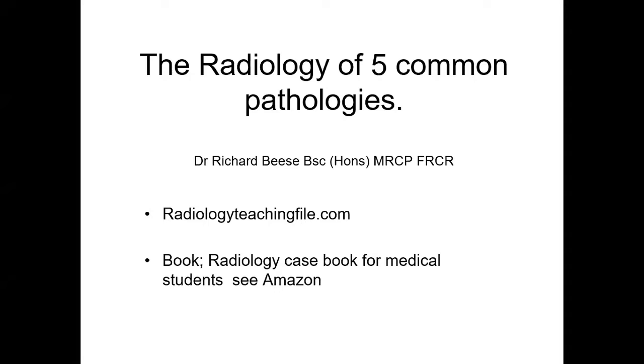in the West. Now, I realize that these do vary around the world. I gave a talk recently on global health through the prism of ultrasound, and we went around the world looking at the uses of ultrasound, and what we saw was that the anatomy was the same, the environment changes and pathology changes. So I'm talking about really 5 common pathologies in my practice, and almost I could summarize 80 to 95% of my work in the NHS in these 5 common pathologies. And I've got to the point where I can actually summarize most of my work in 28 words. So let's go through these pathologies and see what I'm talking about.